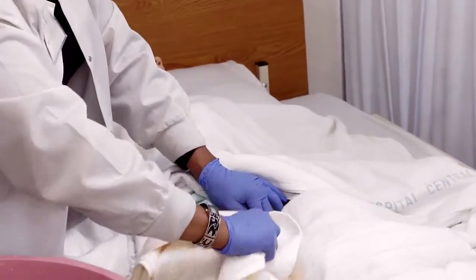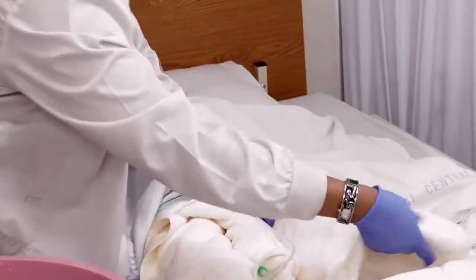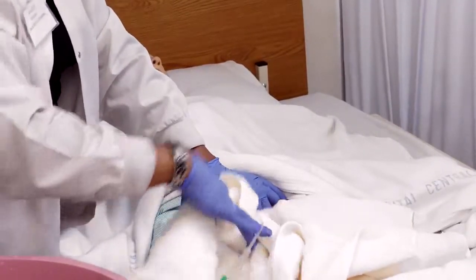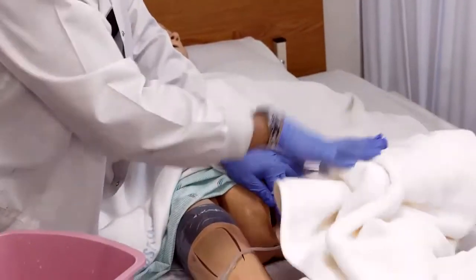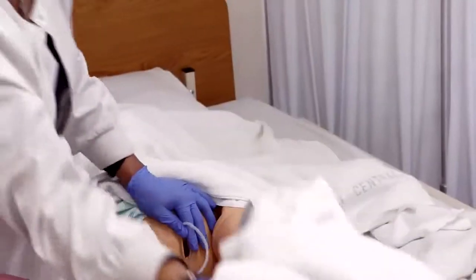So we wash twice. We rinse twice, and then we dry twice, always using a different flap. Twice. Continue to hold onto the catheter. Then we take the towel, we roll it out, away from you and away from the patient, being careful not to pull the catheter out. The towel goes into the dirty laundry.